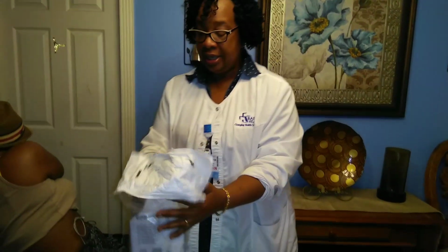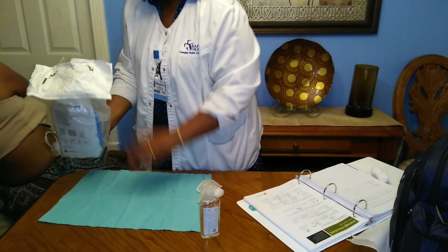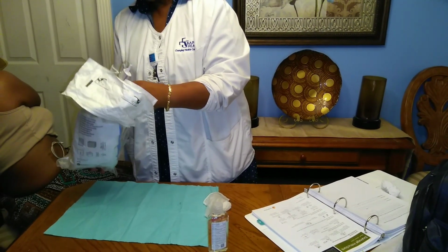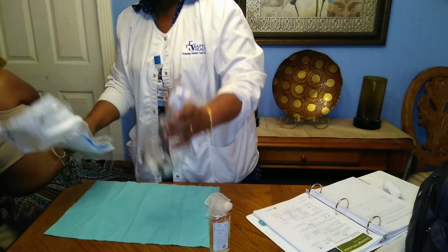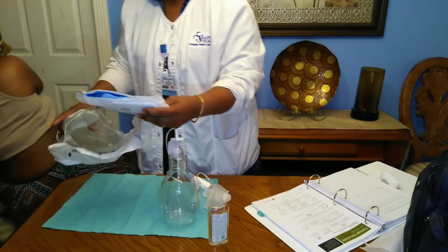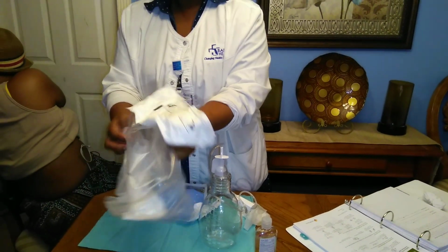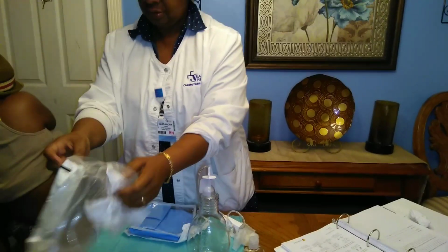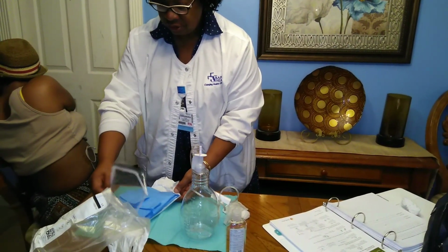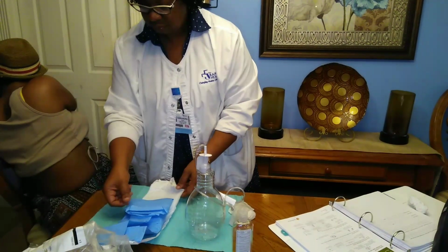I take my kit. Try to get you a fill here on the patient's table someplace if you have one. I take out the bottle. Place it on my barrier. Inside of there is a sterile kit. I usually use this too for my trash. I open this using the sterile technique, away from me first.